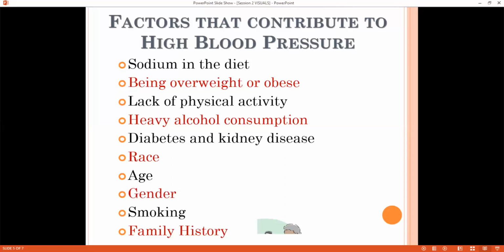The person who measures your blood pressure squeezes the pump rapidly to fill the cuff with air until the pressure of the cuff against your arm temporarily closes off the blood flow in the main artery of your arm. Some blood pressure monitors have an automatic pump, and that's what you have. This person then places a stethoscope on the inner crease of your elbow over the artery in order to hear your heartbeat when the blood begins moving through the artery again. Some monitors have a built-in stethoscope, which once again, is what you have.